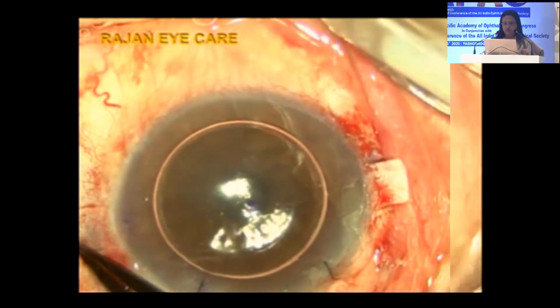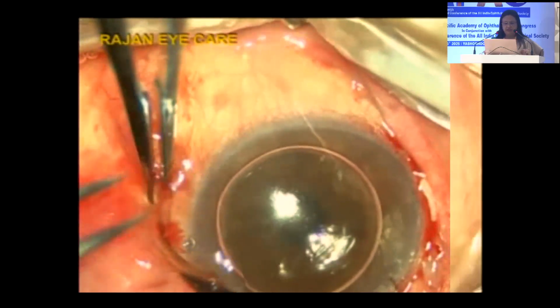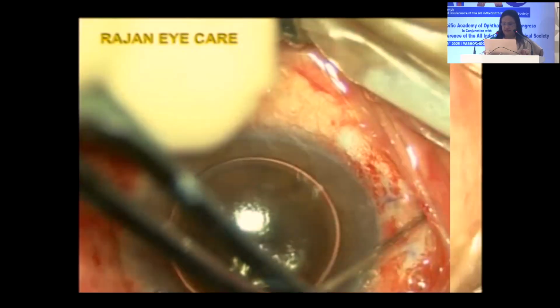So this is a post-operative video of the same patient. This is after the glue has been placed and the flap and the conjunctiva is glued.